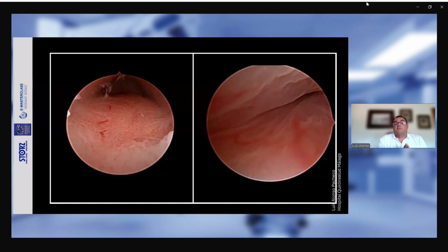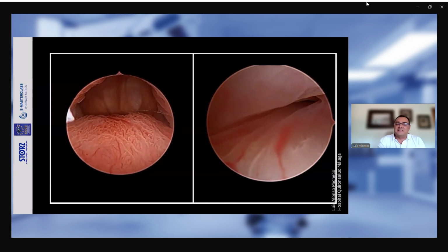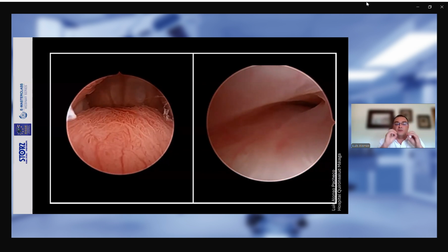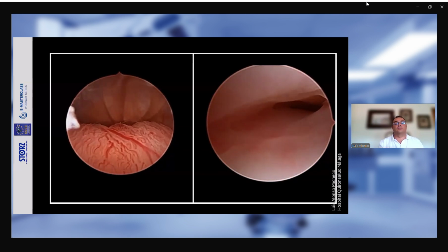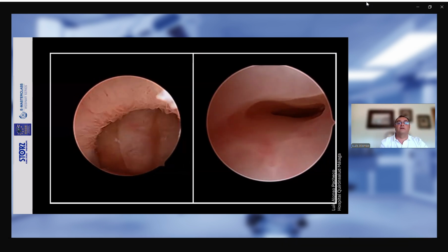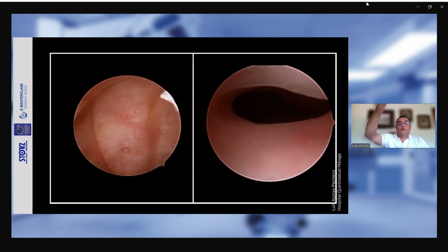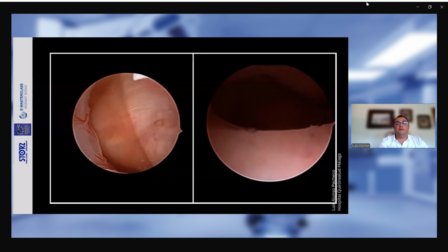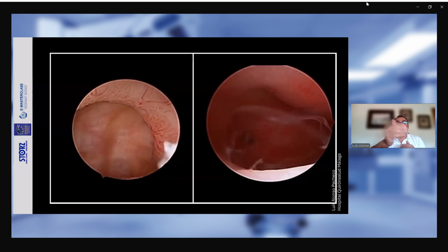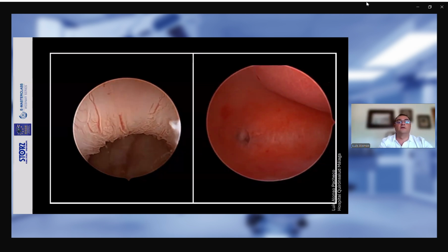But for me, the best method, of course, is hysteroscopy. So hysteroscopy plays an essential role in the diagnosis of this condition. Hysteroscopy allows for a direct visualization of the defect. And during the hysteroscopy, what we see is a pseudocavity in the anterior wall of the lower uterine segment or in the upper third of the cervical canal. And we can see a double arc and a space in between.